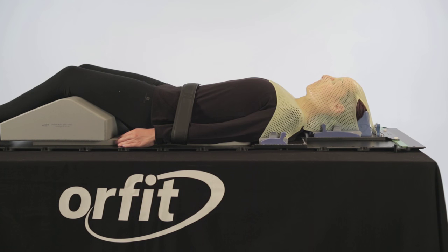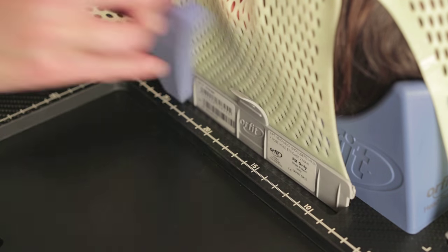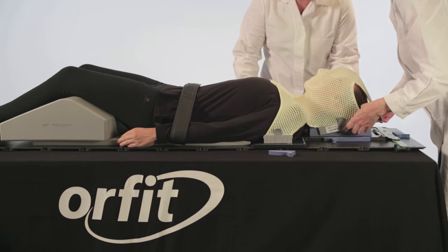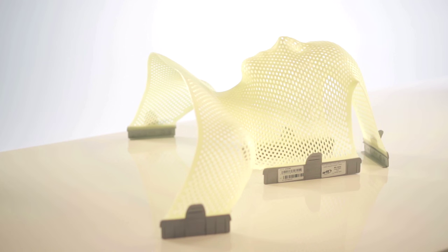After 10 minutes, the mask may be removed. Gently remove the profiles and lift the mask from the patient. The mask will continue to harden in the next 24 hours.